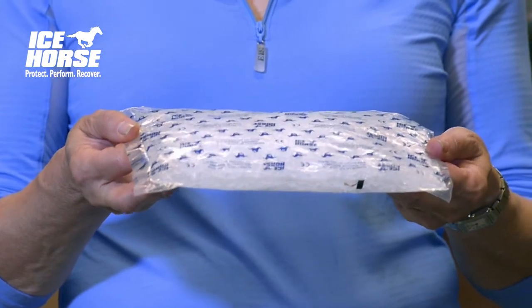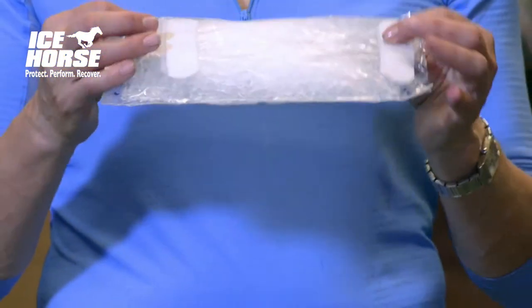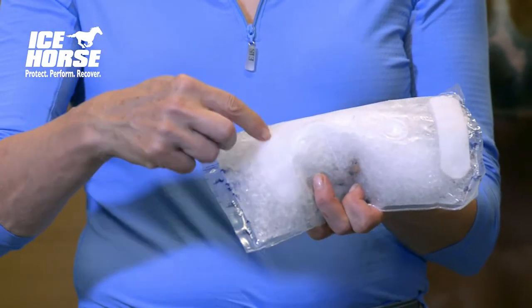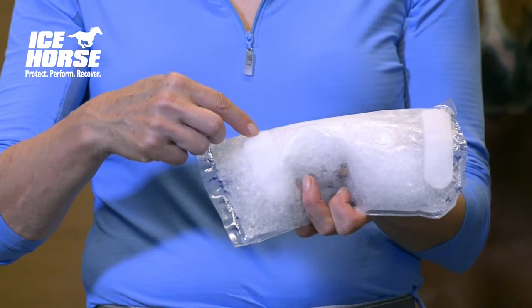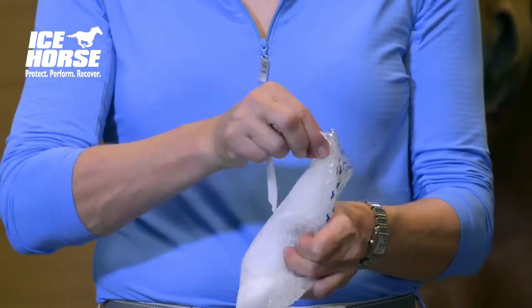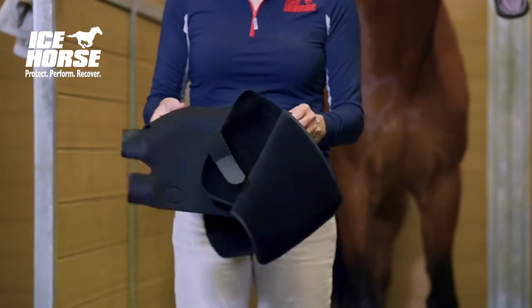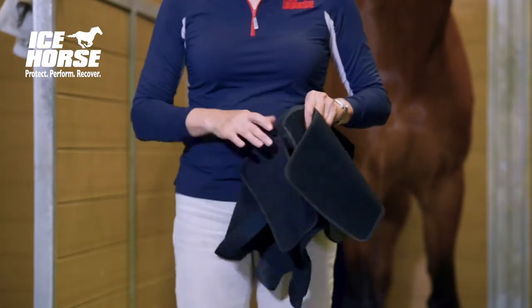When you remove your ice from the freezer, it will look like this. Flip the packs over and remove the covers from the velcro strips so that it will stick properly to the landing pads. Open up your wrap and apply the ice to the landing pads.